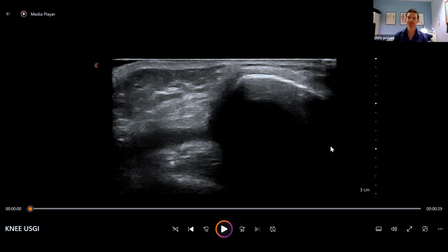Sure. Yeah, absolutely. And without going into too much detail, the old debate about landmark versus ultrasound. Any thoughts there? Yeah, I guess, look, I did landmark injections for 6-7 years, maybe even longer. Definitely when you start using ultrasound, you'd never ever go back to doing anything landmark.